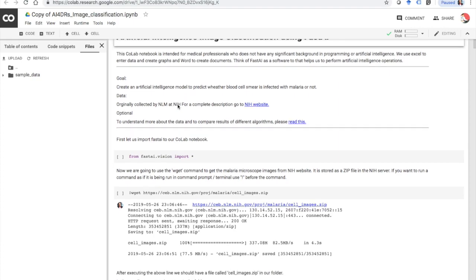Here we are planning to create an artificial intelligence model to predict whether a blood smear is infected with malaria or not, and we are using data from NIH. To get more information about the data you can click and go to the NIH website. If you want to understand more about the data and to compare results of different algorithms, click here — that's not really essential but you are free to explore.